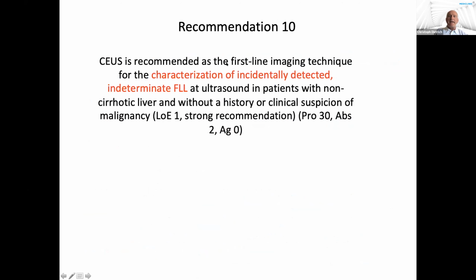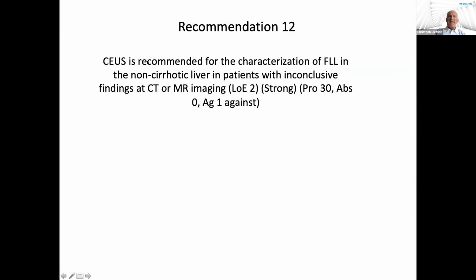CEUS is recommended as a first-line imaging technique for the characterization of incidentally detected indeterminate focal liver lesions at ultrasound in patients with non-cirrhotic liver and without a history or clinical suspicion of malignancy. There is a high level of evidence and a strong recommendation. CEUS is recommended for the characterization of focal liver lesions in the non-cirrhotic liver in patients with inconclusive findings at CT or MRI imaging. Also, high level of evidence and strong recommendation.